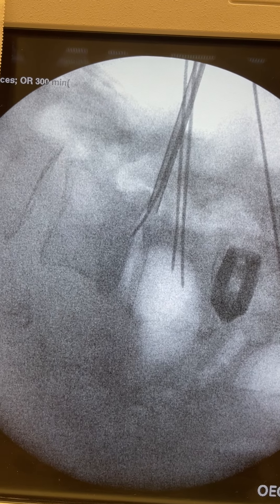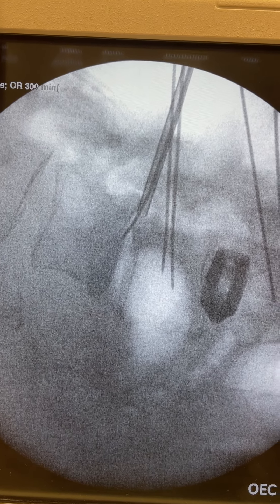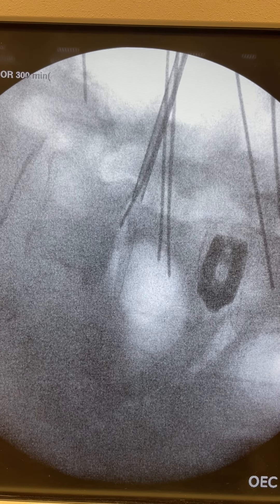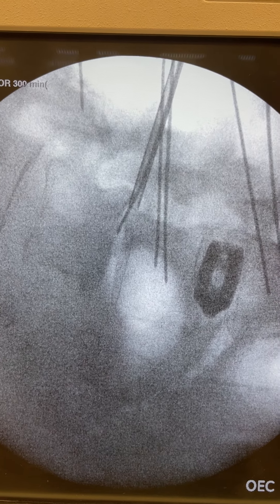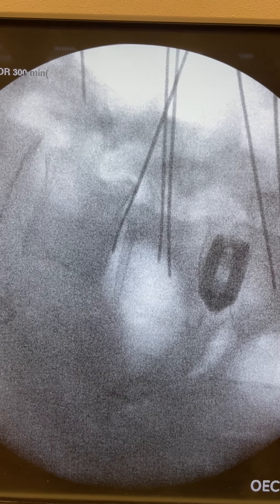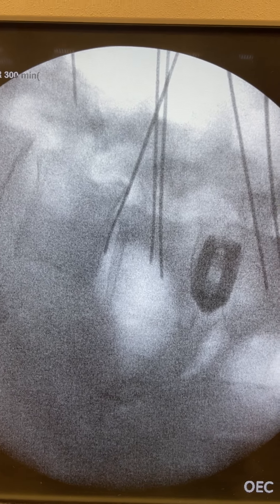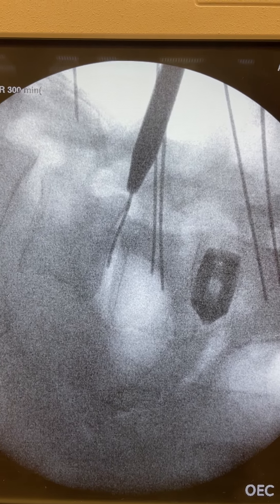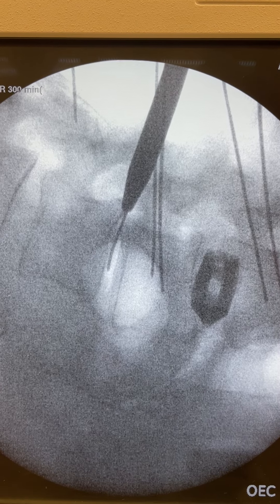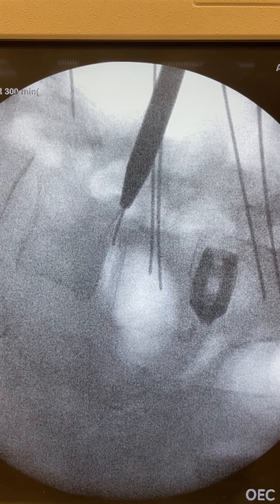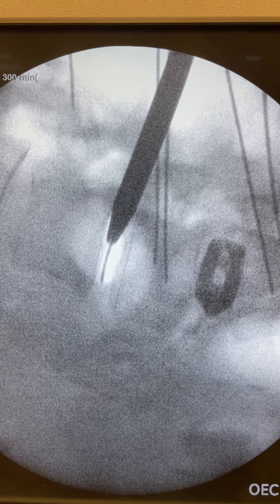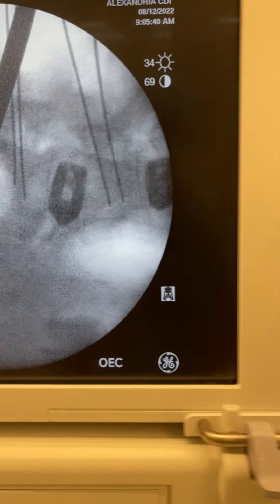And here you see, once I bend and go over it, I then turn the direction and approach it more. This enabled me to put the K-wire in the middle of the disc so that when I'm dilating, the dilator just follows the same path and opens up this space as you see here.